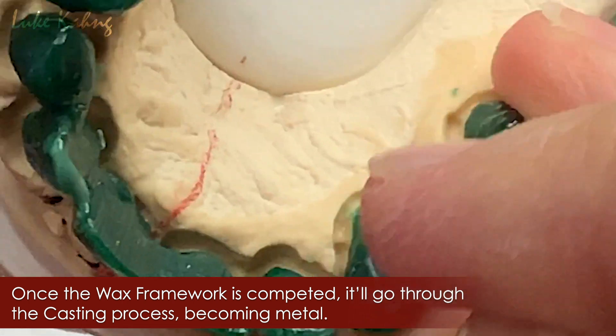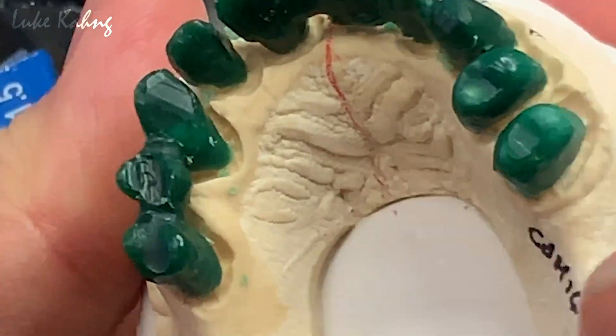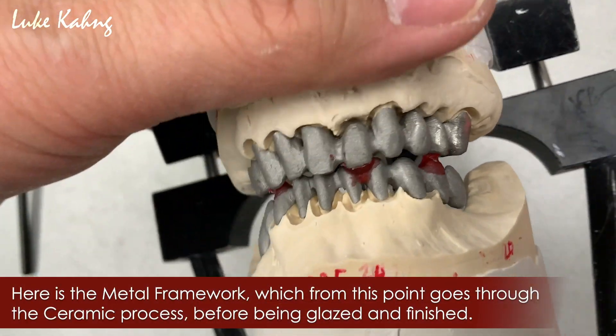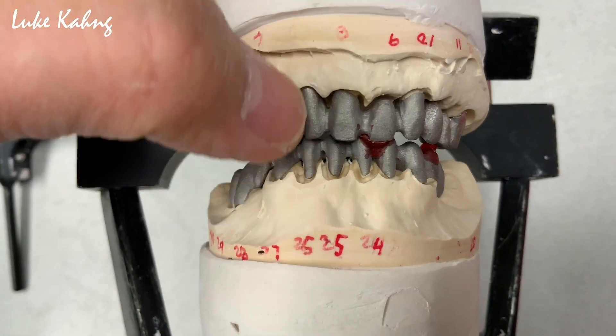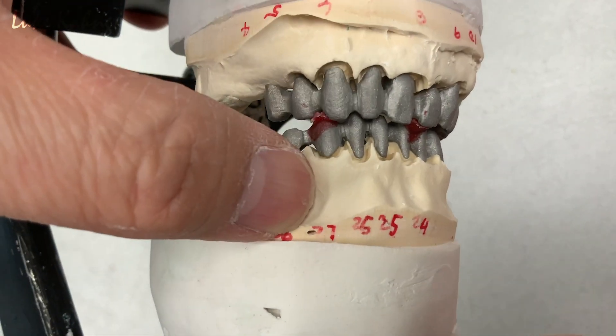Cut it. Then premolar — that's good. It's a full mouth case. So we finished the wax-up, and then cast metal with a semi-precious metal. Now we got a really good design: central size, lateral and canine, and the vertical size.